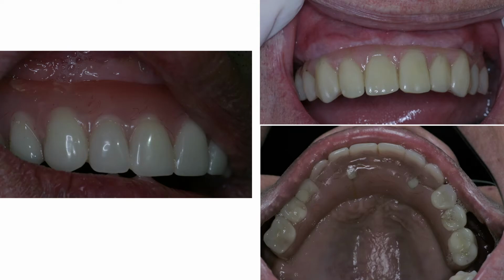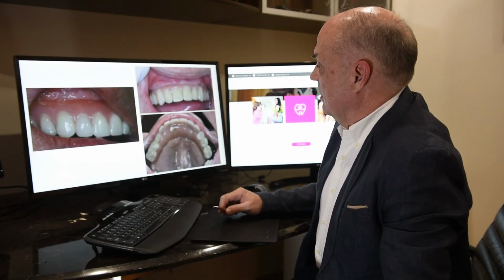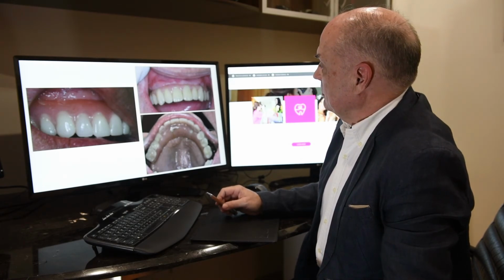Now, there are a few claims that are made about these techniques. One thing they'll say is that it's a revolutionary technique. Well, the revolution in the mandible is simply to tilt the implant, and that hasn't shown to be any advantage. There's probably no disadvantage, but there's no real advantage in most cases. Slight biomechanical advantage to the framework, but there's no clinical advantage to the implants.